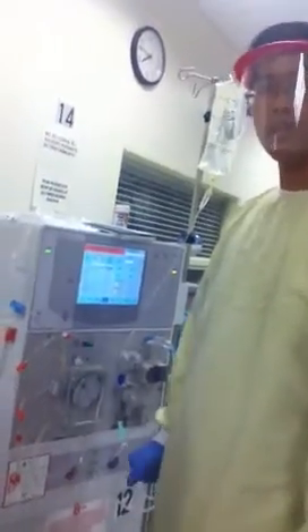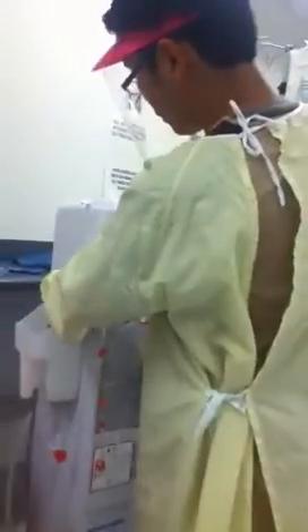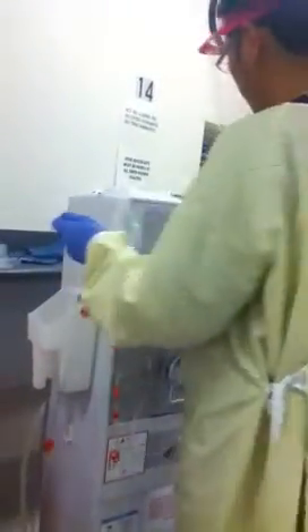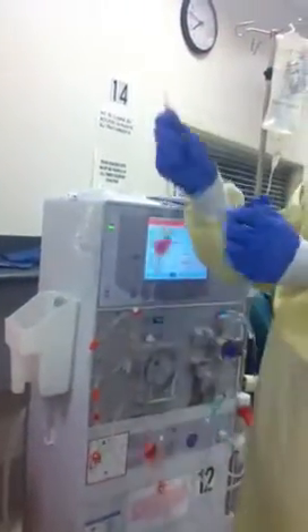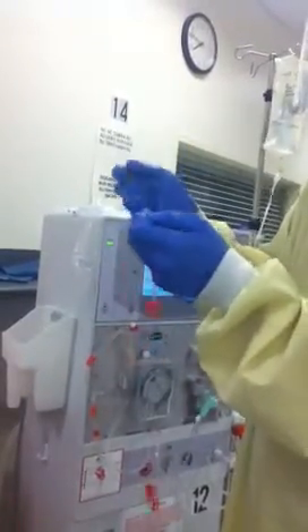Now let's go to connecting it to the patient. First thing you need to do is to get this port that goes to the patient, then you just put it into the patient port.